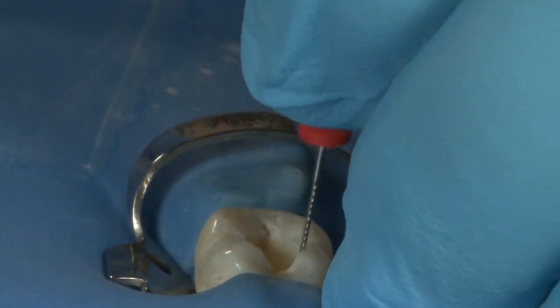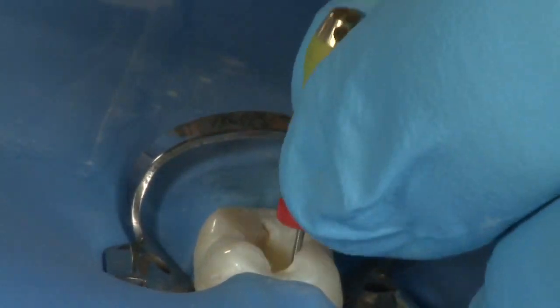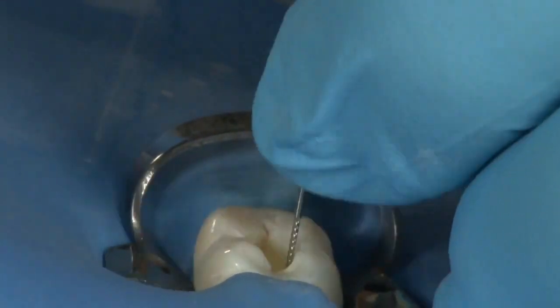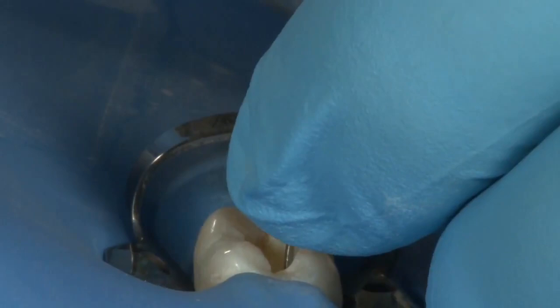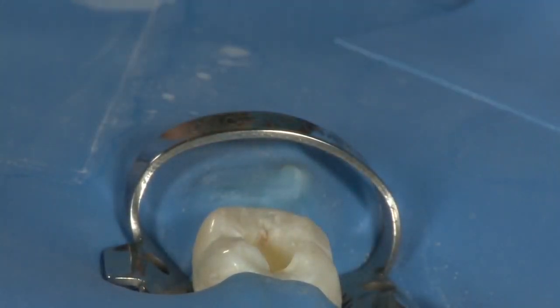Using the gentle watch winding motion, take the number 20 stainless steel hand file to working length. The shaping file and the hand file are crucial steps for removing interferences in the middle third of the canal and creating a glide path for the safe use of the NiTi transitional files.